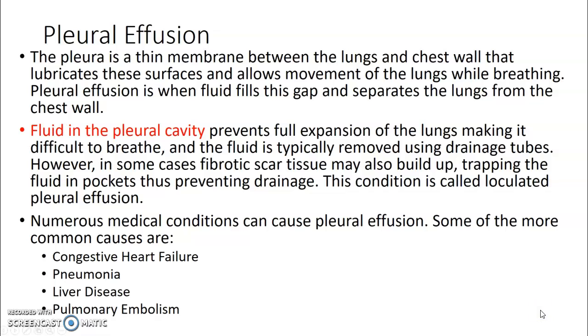Right. What is pleural effusion? We just went over that again. But there's multiple medical conditions that can cause it. Some most often are congestive heart failure, pneumonia, liver disease, and pulmonary embolism. We do these views most often on post-operative cardiac patients.